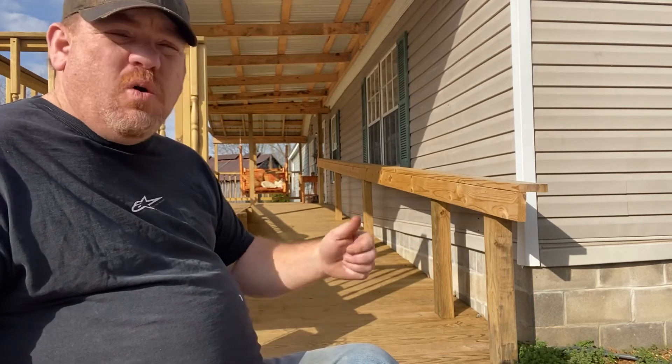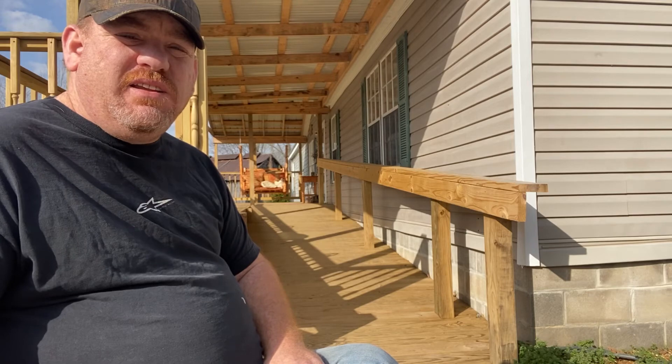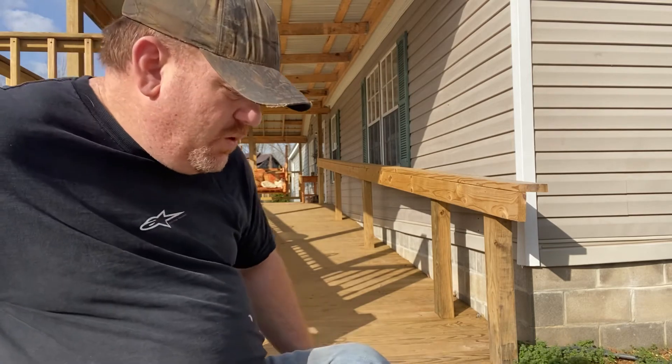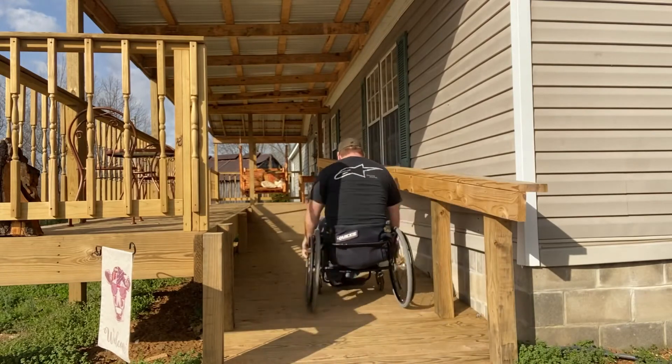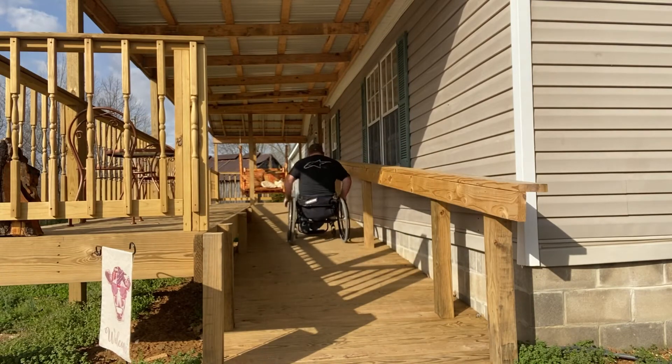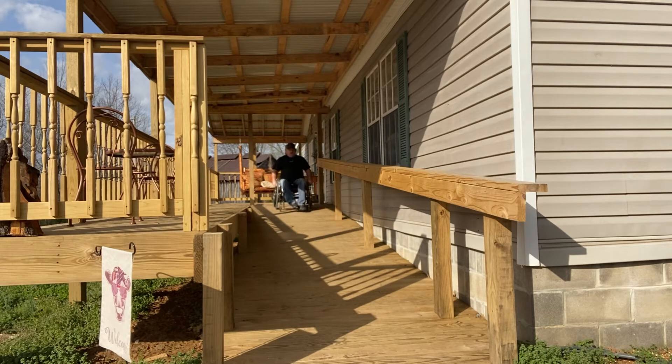I'll go up the ramp and come back down to show y'all how easy it is to get up and down. Like I said, we just ease right up it. Now we're up at the top — really smooth, not hard to do at all.